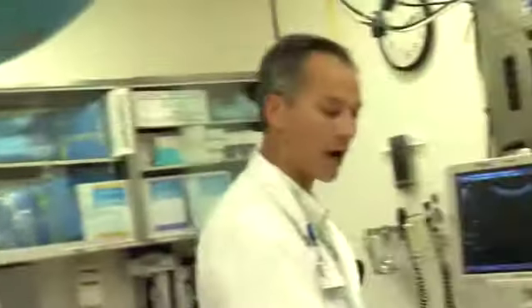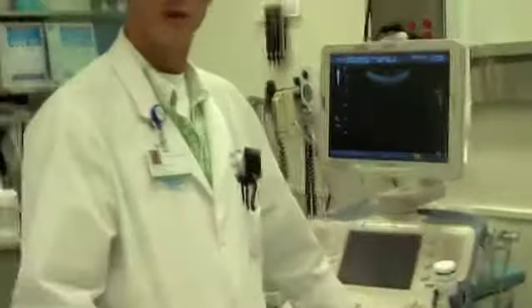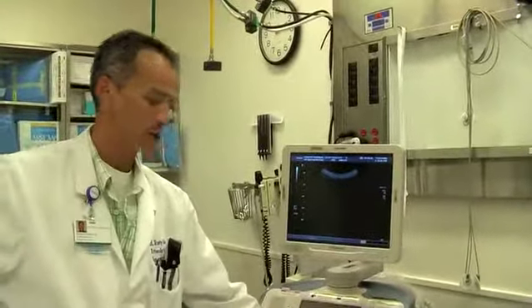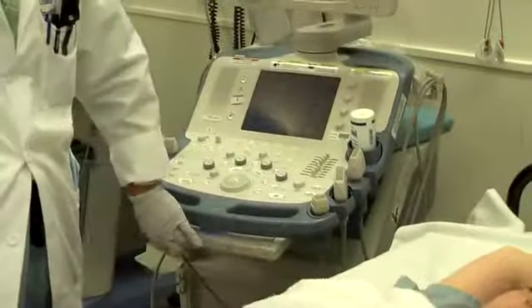So for the aorta study, we're going to start high. Going to freeze there. The next application we're going to do is the aorta. We've already put in our patient information. We've determined the probe that we're going to use, which is our curvilinear C60, our workhorse probe. Close up our workstation, and our patient is now prepped and ready to go.